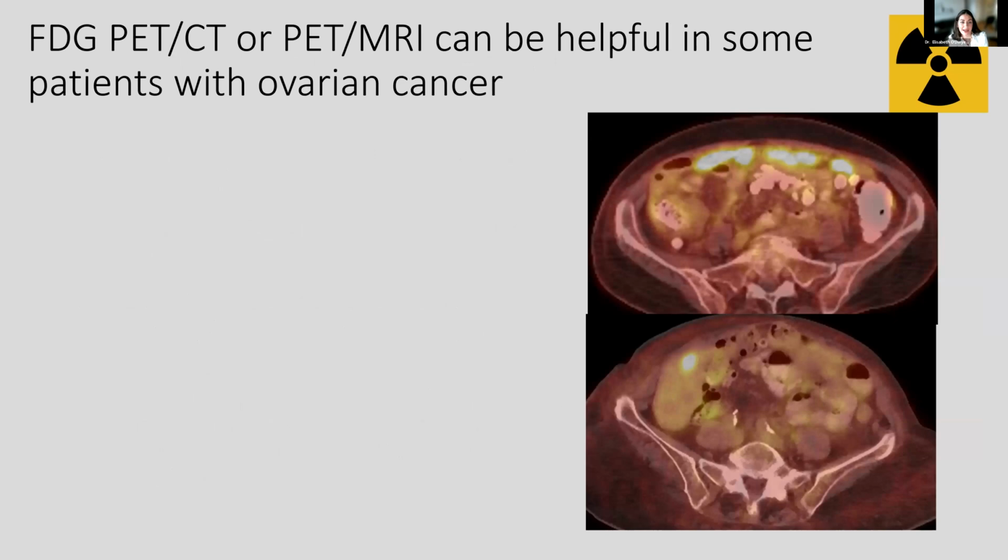So when can FDG PET be used? So this is PET CT. When do we use PET and when is it helpful? It's useful in certain circumstances. For people who haven't seen it, this is a PET CT, which is very different from the prior studies that we have talked about.